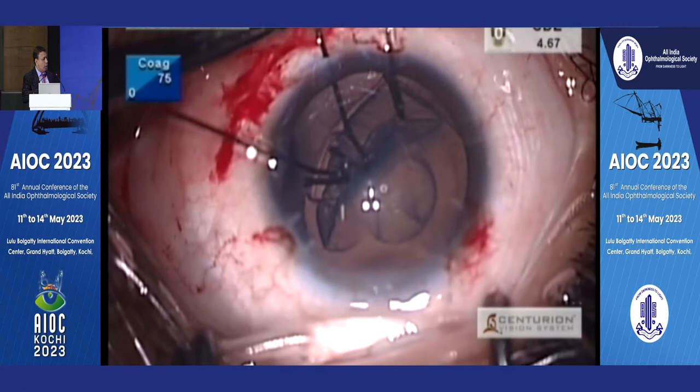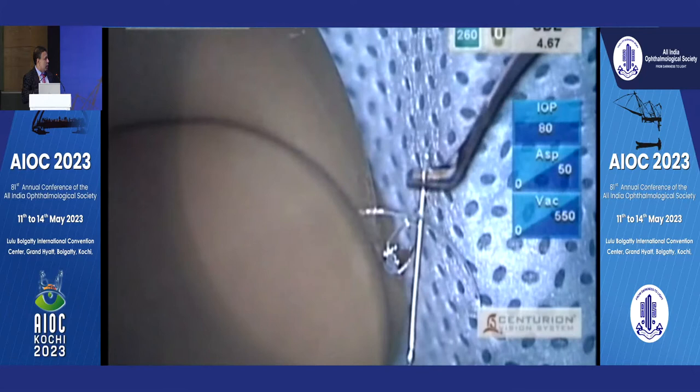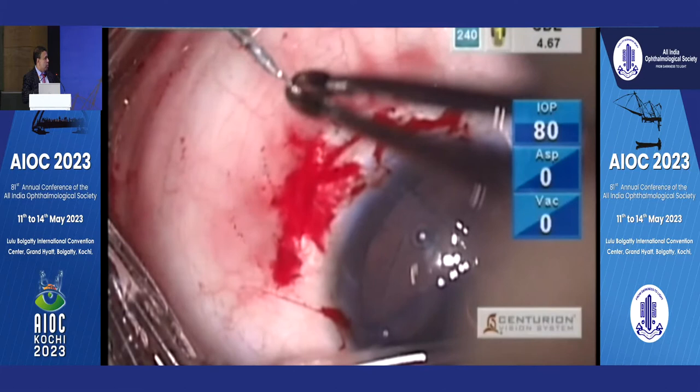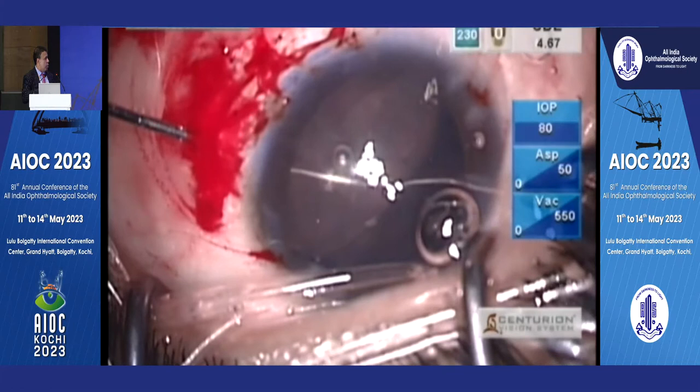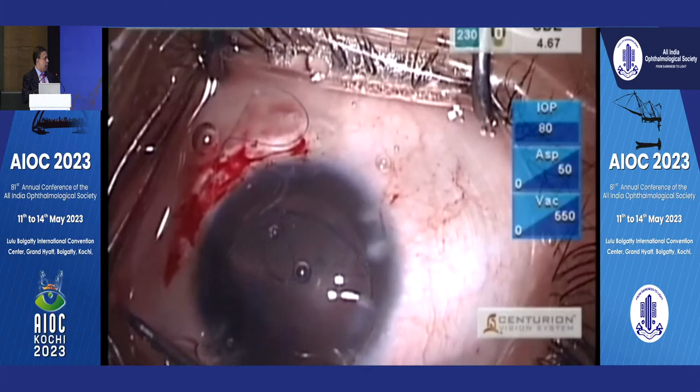Then use sodium hyaluronate or Healon basically to push the cortex away and put capsule hooks. I learned this from Ike Emad — he always used capsule hooks and never iris hooks, whereas I always used iris hooks. Suck out the contents, and this is a Gupta ring segment made by Madhu. Railroad it out of the eye — that's pretty straightforward. You railroad both the double-arm suture out of the eye, put the ring segment in the capsular bag, and now the rhexis will center when you tighten it.